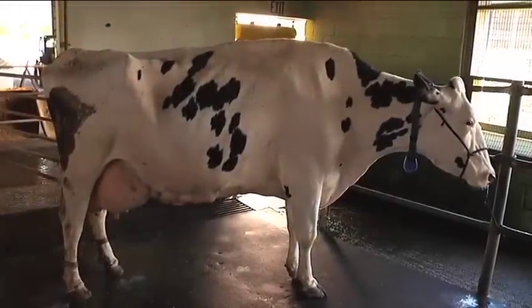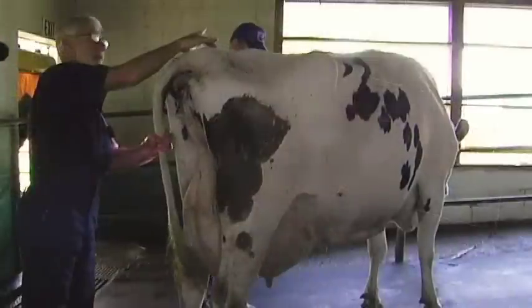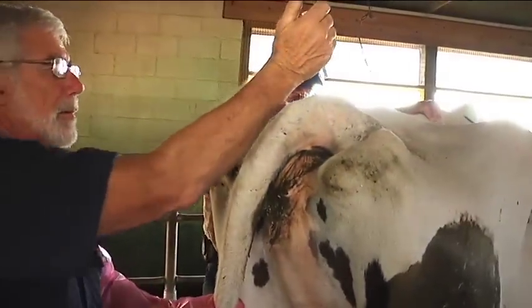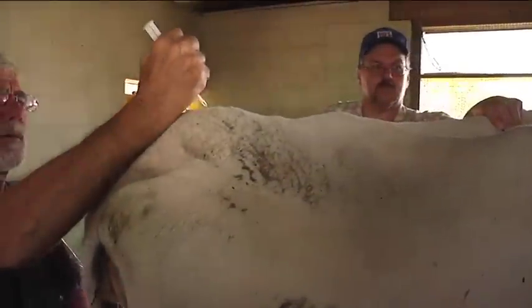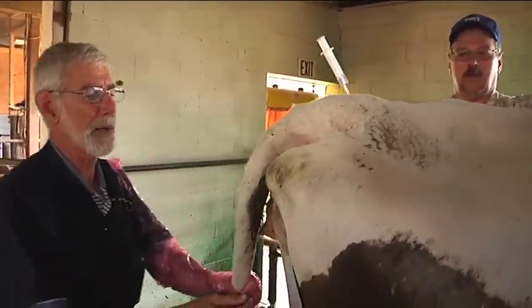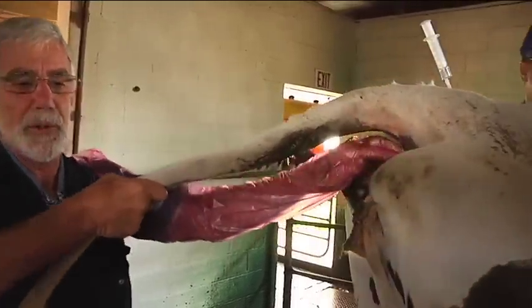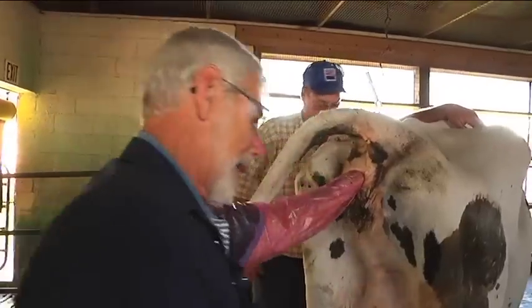The first step is to anesthetize the back half of the cow. An epidural is administered to block the rectum so the cow doesn't force down on the hand while palpating. The injection goes in next to the spinal cord and blocks the whole area including the rectum.